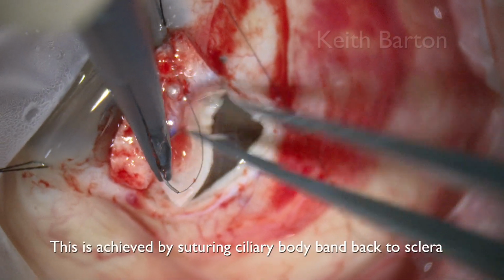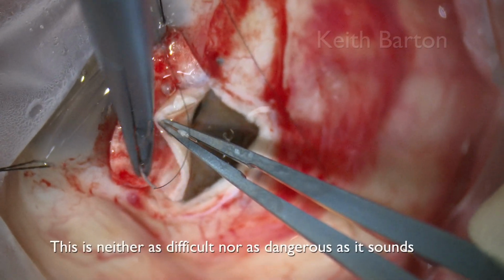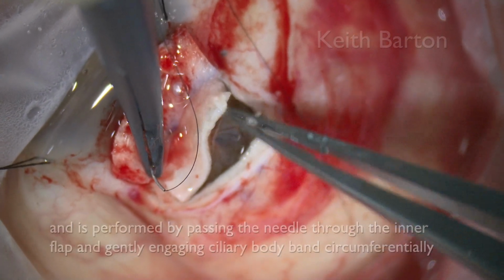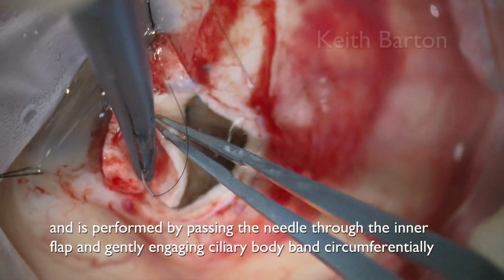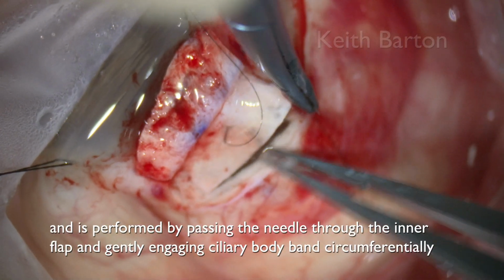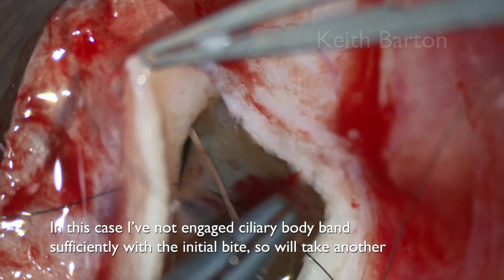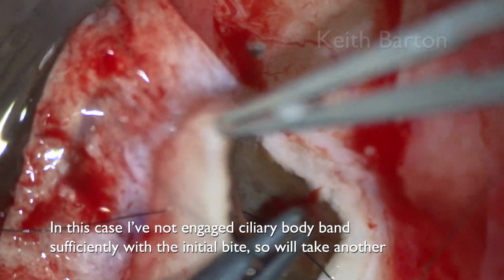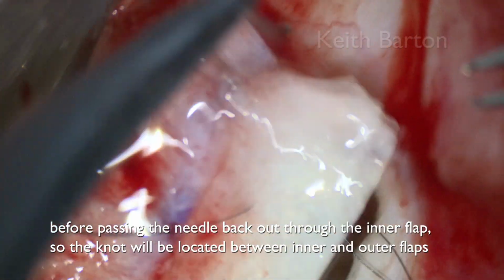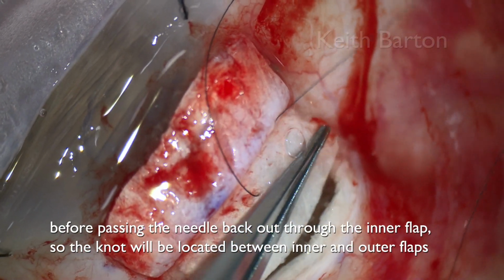This is achieved by suturing ciliary body band back to sclera. This is neither as difficult nor as dangerous as it sounds, and is performed by passing the needle through the inner flap and gently engaging ciliary body band circumferentially. In this case, I've not engaged ciliary body band sufficiently with the initial bite, so I will take another, before passing the needle back out through the inner flap so that the knot will be located between inner and outer flaps.